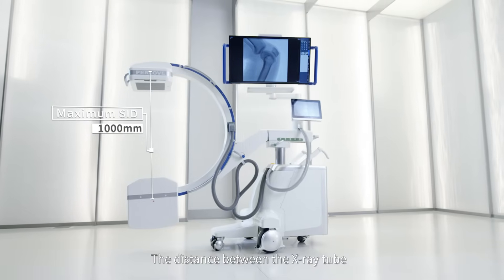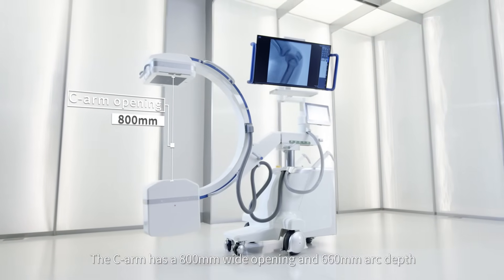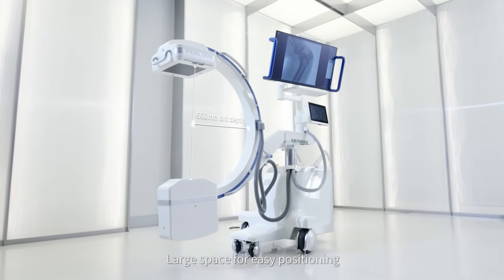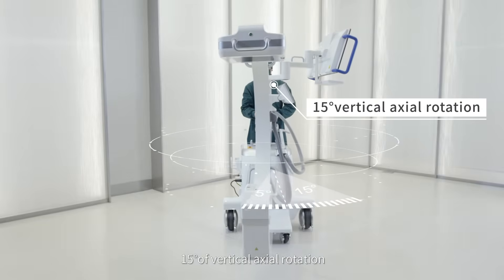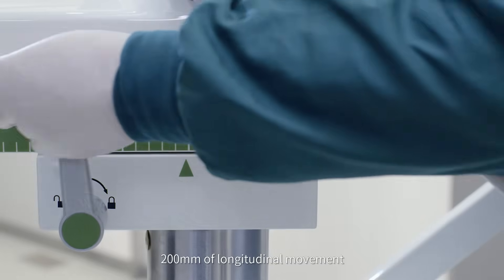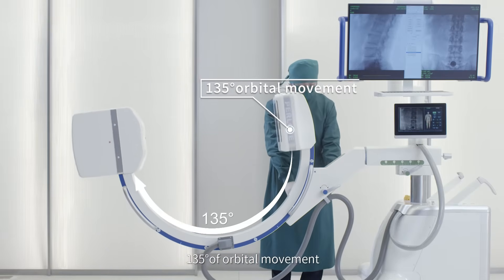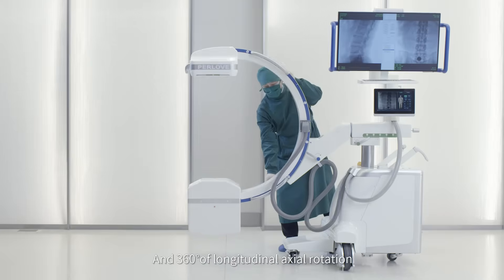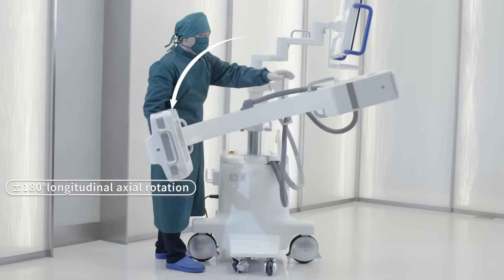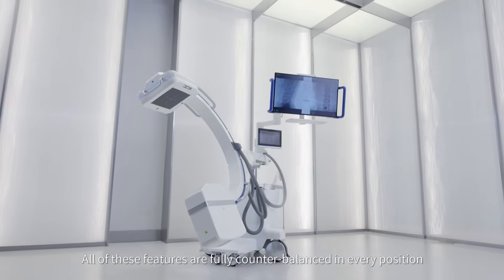The distance between the X-ray tube and the flat panel detector is 1000mm. The C-Arm has an 800mm wide opening and 660mm arc depth, providing large space for easy positioning. It features 15 degrees of vertical axial rotation, 200mm of longitudinal movement, 135 degrees of orbital movement, and 360 degrees of longitudinal axial rotation — all fully centered and counterbalanced in every position.